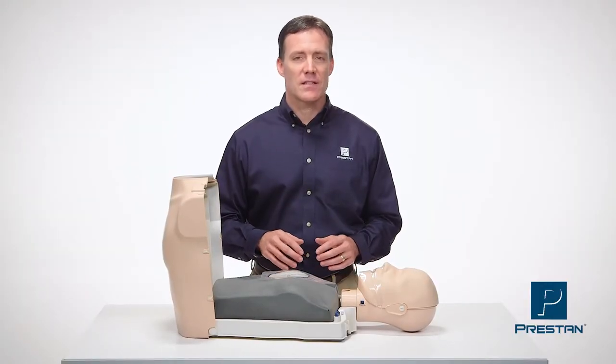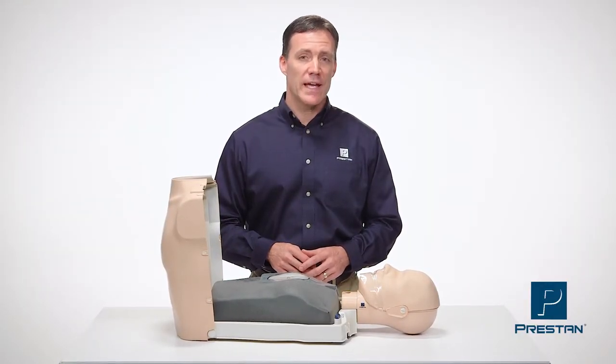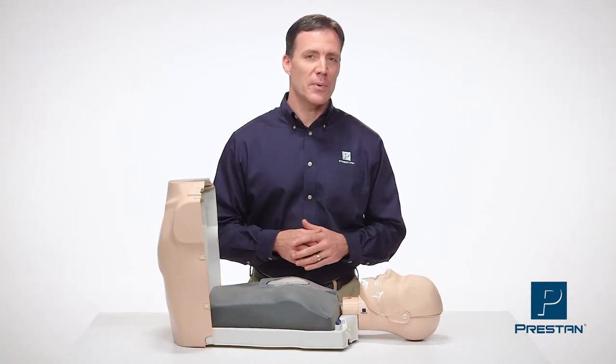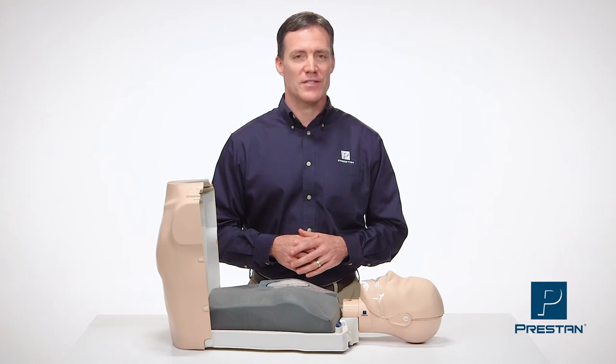Remember, lung bags, individual face shields, and valves should be replaced after each class. All these products can be purchased from your Prestan authorized distributor.